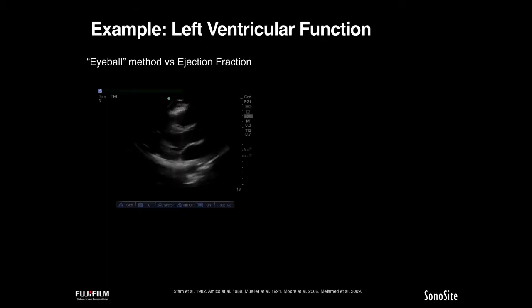And I'd like to review the eyeball approach in particular with the left ventricle and highlight its value and why we use this approach. Well, the literature featured at the bottom here is very clear. Across multiple specialties and in multiple decades, we've demonstrated that point of care practitioners using a very pragmatic training approach can routinely and accurately assess LV function and are very accurate when compared to a gold standard of diagnostic echocardiography.